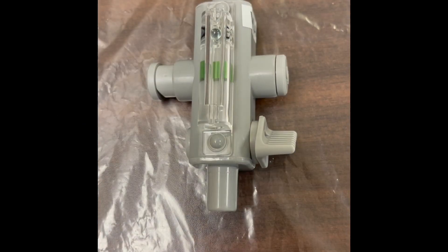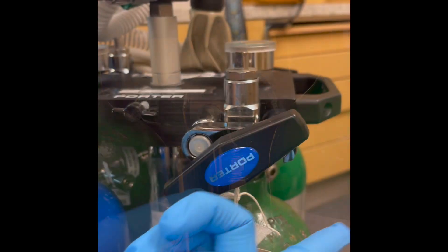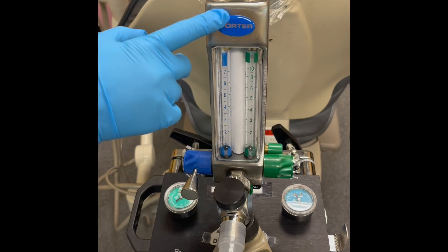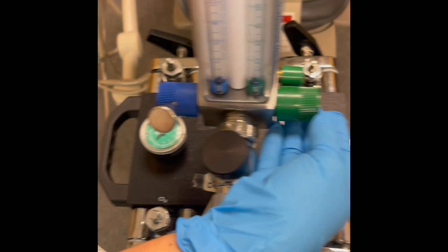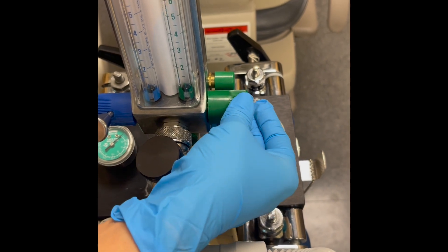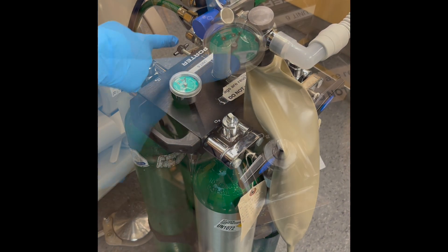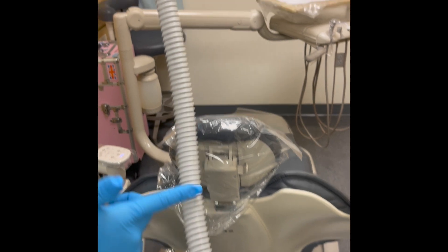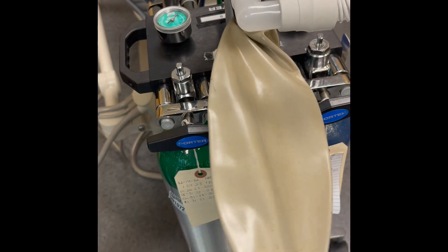The components include: the scavenging and evacuation system, the nasal hood and hose, the pressure reducing valve, the pin index safety system, the log sheet, the key to open and close the tanks, the flow meter and the knobs, the yoke, the pressure gauges, the anatomical dead space, and the reservoir bag.